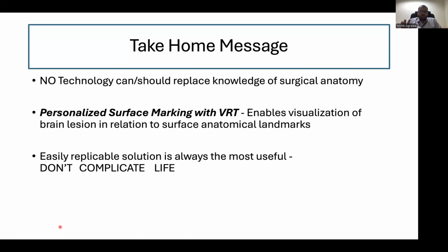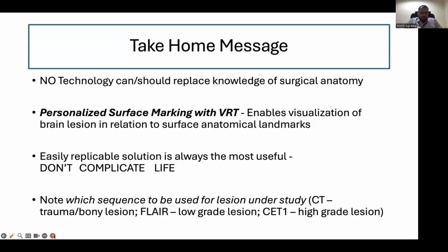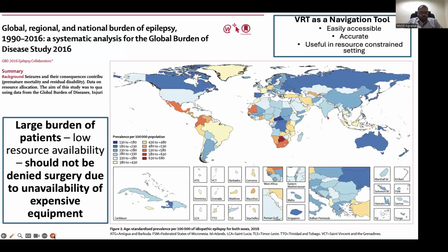You don't need to complicate your life unnecessarily using navigation and MRI, and don't ever let anyone tell you that you don't have this high-end technology, so you cannot operate, you cannot do a localized, beautiful technique to resect your tumors. In the end, I would like to say that VRT as a navigation tool is easily accessible, accurate, and useful in resource constrained settings.